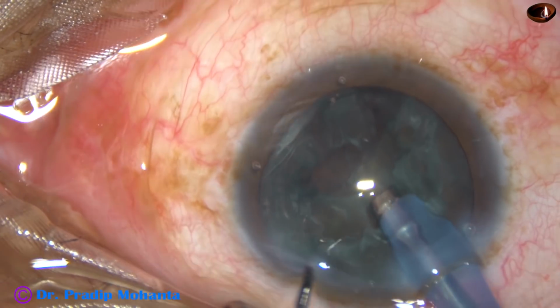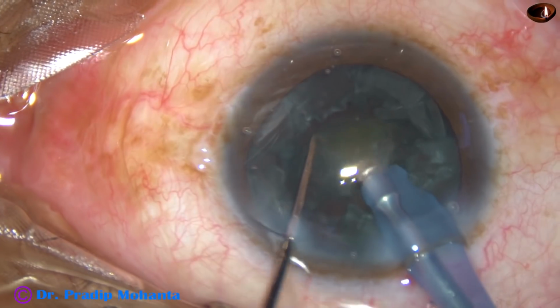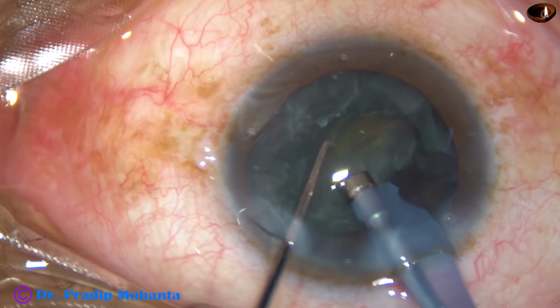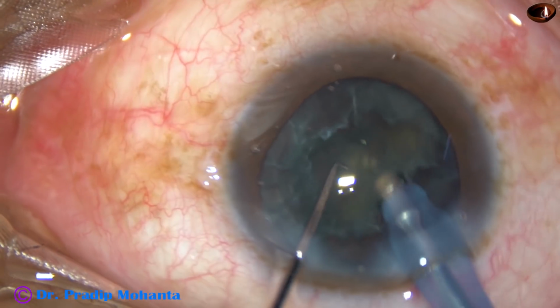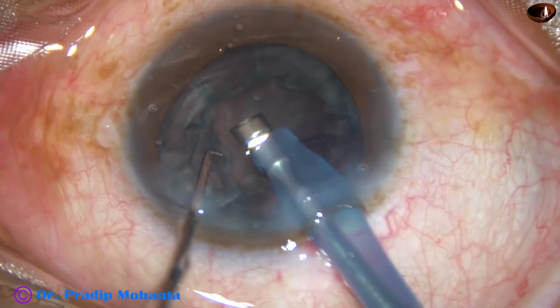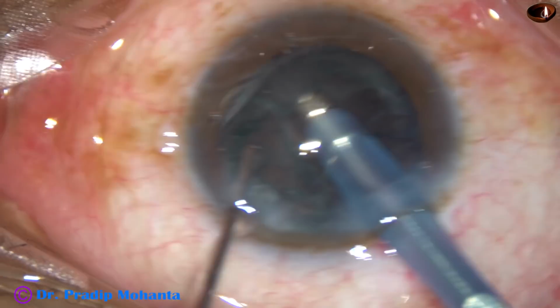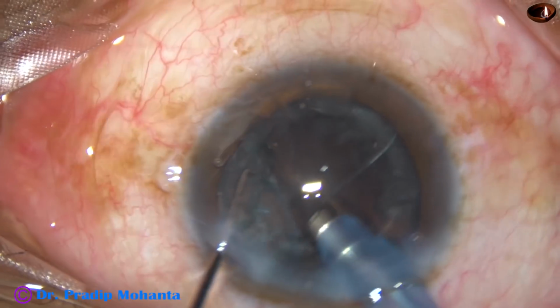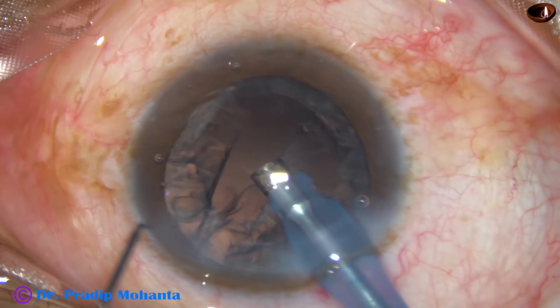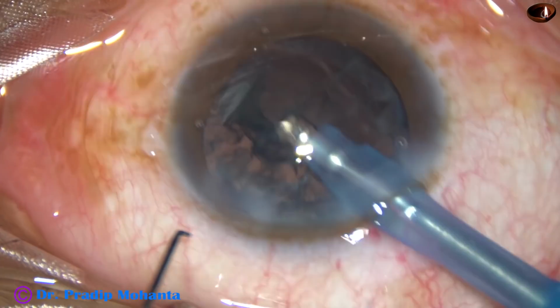So divide and conquer technique is a universal technique for all kinds of cataracts. For soft cataracts also we can do this. Only thing is we have to spend a little more time than lens tilt technique or carousel technique, but doesn't matter. Safety is most important. Let me repeat. Safety is more important than speed of surgery.